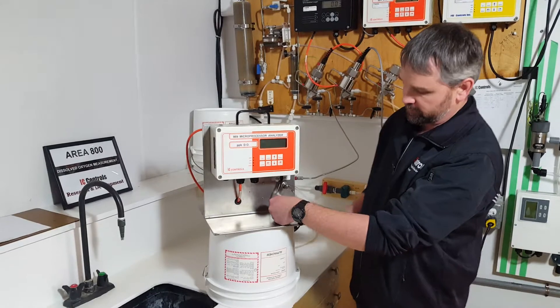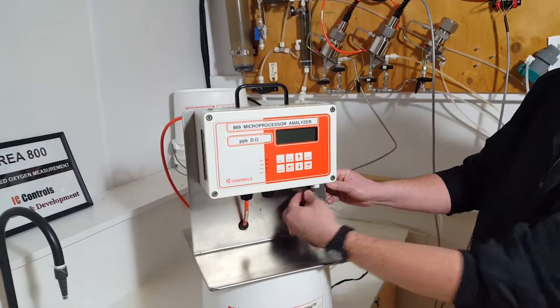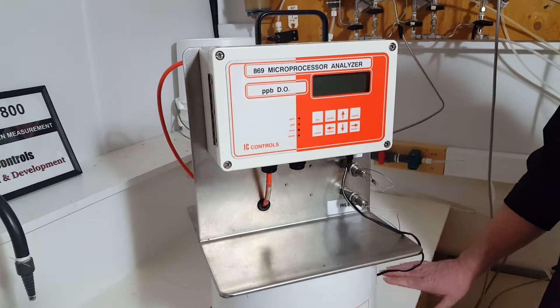First off, this is your power cord. There's a little connection here, power goes on, and then your other end goes into the 115 or 230 volt supply.